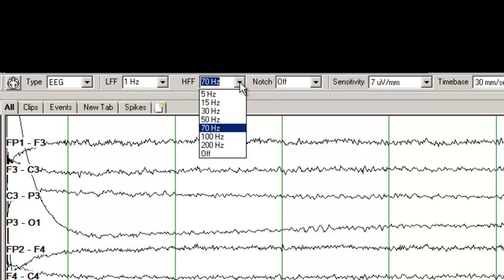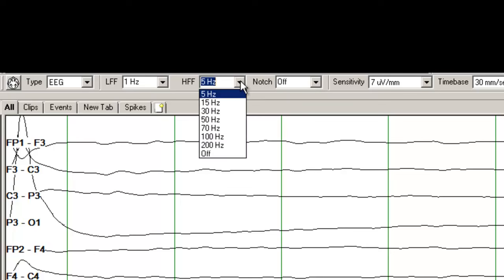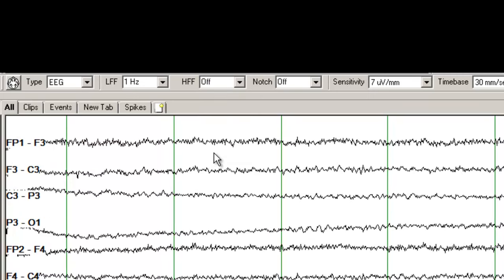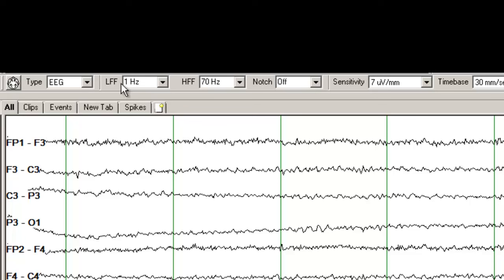This is a high frequency filter, which is used to get rid of the higher frequencies. If I set it at 5 Hz, you see basically all the faster frequencies are gone. If I turn it off, all the fast frequencies are recorded and you see all the muscle artifact and the beta frequencies. Normally we set this at 70 Hz. So the low frequency filter is typically set at 1 Hz, high frequency at 70 Hz — those are often the default reviewing parameters.